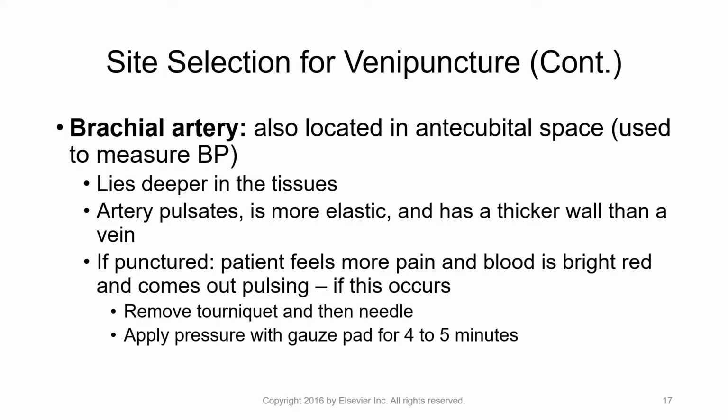Remember I said earlier, arteries are going to bleed for longer than veins do, and it's harder to stop the bleeding. So steady, firm pressure for 5 minutes at least.